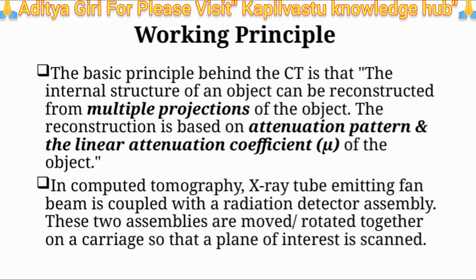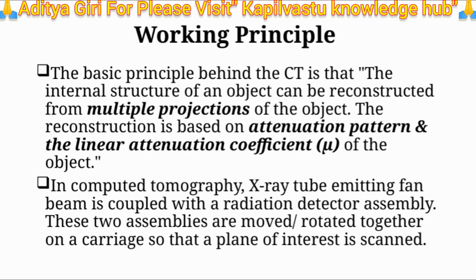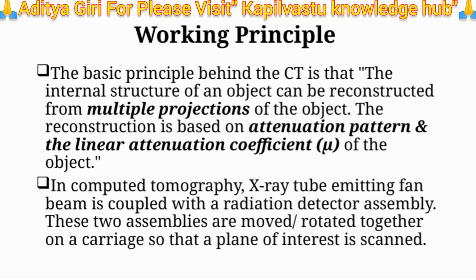This coordinated movement allows us to collect multiple projections from different angles, which are then used to reconstruct a detailed cross-sectional image of what's inside. This entire process exemplifies how the internal details of an object can be revealed non-invasively, highlighting the powerful combination of physics and engineering that makes CT a vital tool in medical imaging.